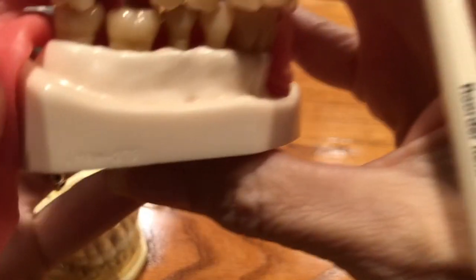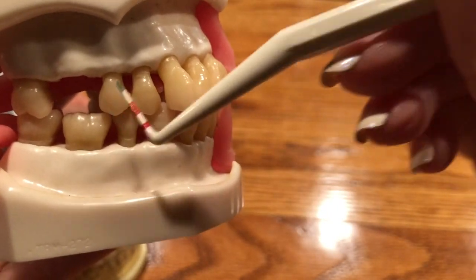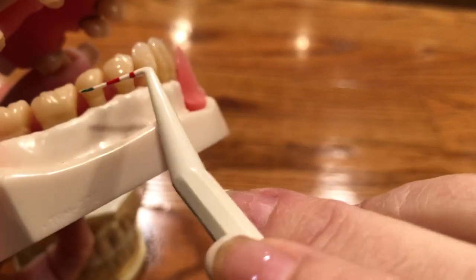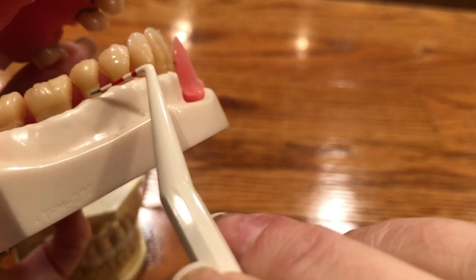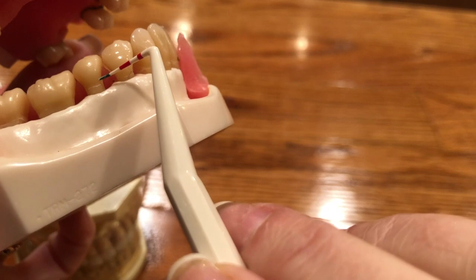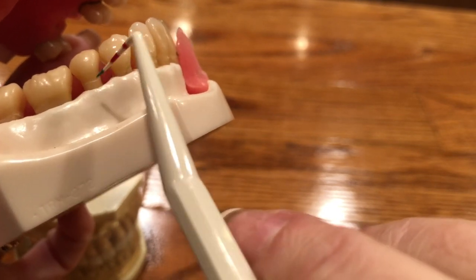So when we take X-rays, we are looking to see, do you have any cavities between the teeth that we can't see? Where is your bone level? Is your bone level up to where it's supposed to be? So you can see that this is where the enamel of the tooth starts. This is the hard part, the enamel of the tooth. And then right where this line is, this is called the CEJ, where the cementum meets the enamel of the tooth. So it's the cemento-enamel junction, CEJ.